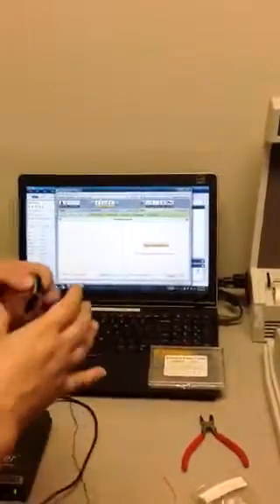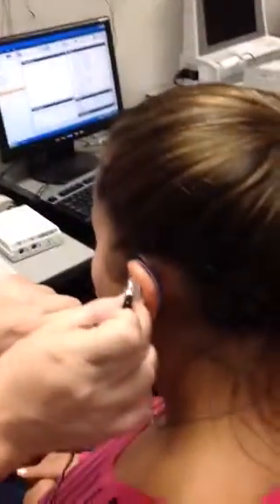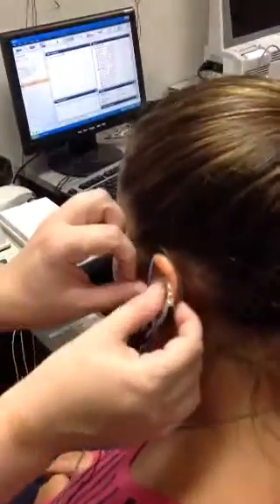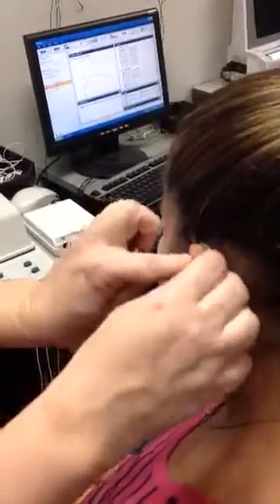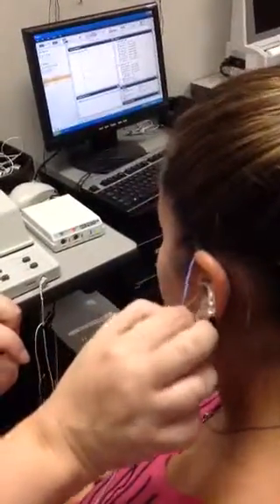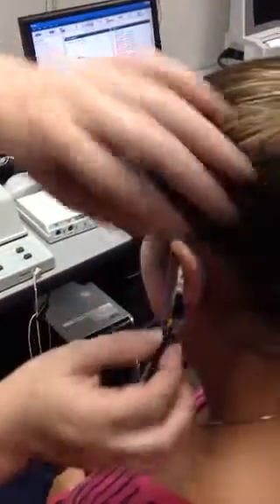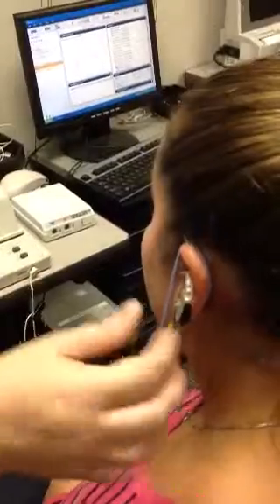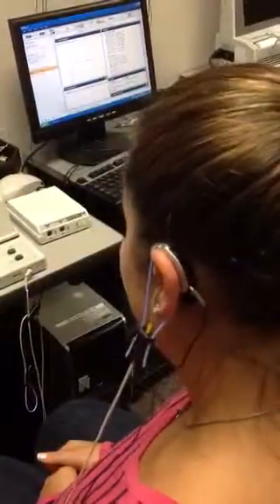So this has some settings in it that are not calculated yet for her, but I'm going to keep it muted just because she's got normal hearing. Oops. So sorry, Lauren. I can see your head moving there. Sorry. I always cringe with that. Well, I pushed it in a little bit further because the ear mold moved the probe mic. Is that okay? Are you feeling a pinch or anything? Yeah, it's fine now. Okay. It just went in a little bit further. Yeah. But the closer it is to the TM, the better your output readings are because it is more in position.